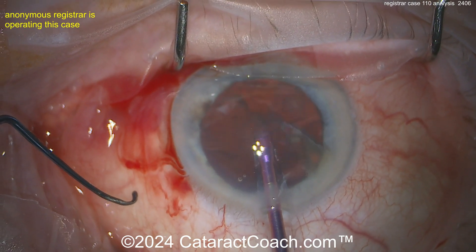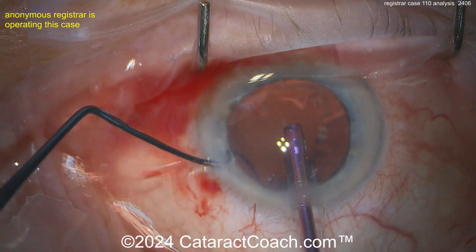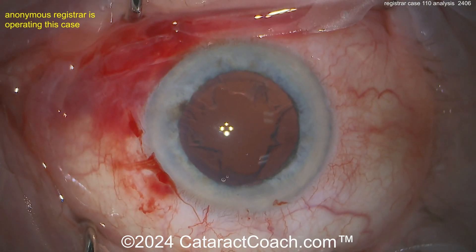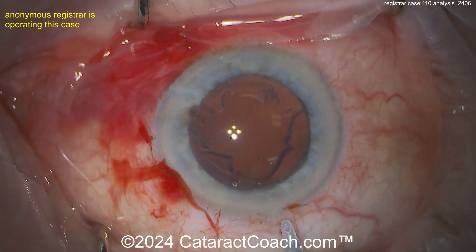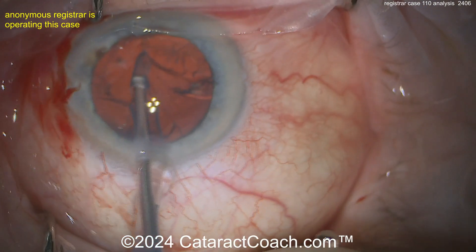To fix this, you need to balance inflow and outflow. The reason they say to take the chopper out of the eye is because you're leaking from the paracentesis — so there's only one source of inflow fluid: the BSS coming through your phaco handpiece. The outflow is what you aspirate through the port, plus what leaks through the incisions.